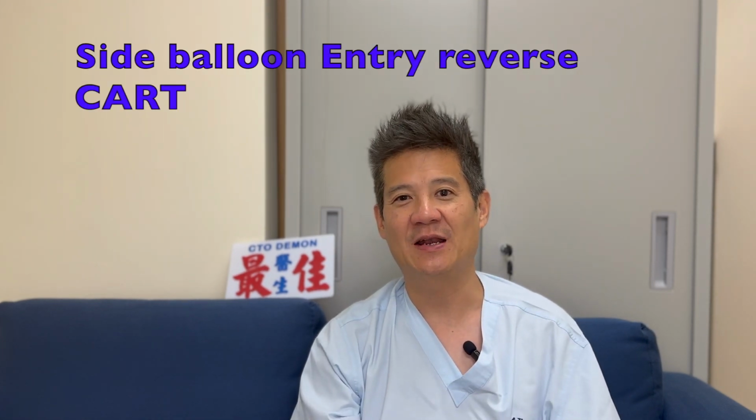So after you point the tip towards the balloon in two perpendicular views, the second operator deflates the balloon and the first operator pushes the wire. Just push, no rotating, no turning, because if you turn, it's going to be in the wrong position. And once you push into the balloon space, you then turn the wire to wire up. That's the classical Dr. Kato side balloon entry reverse CART. I call it side balloon entry, SBE, because you're entering from the side.